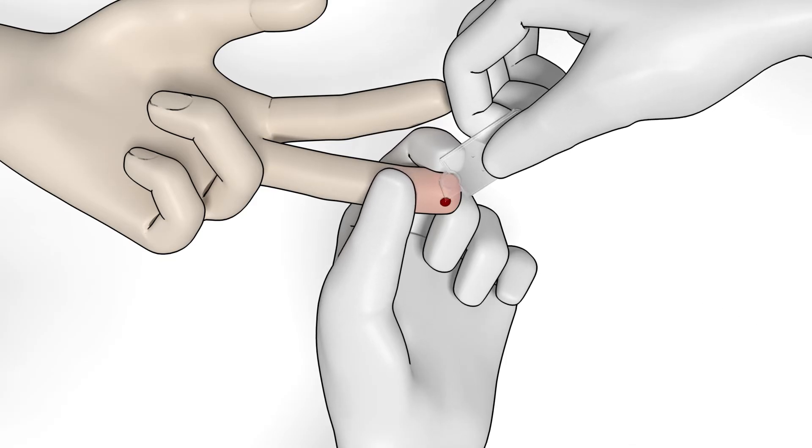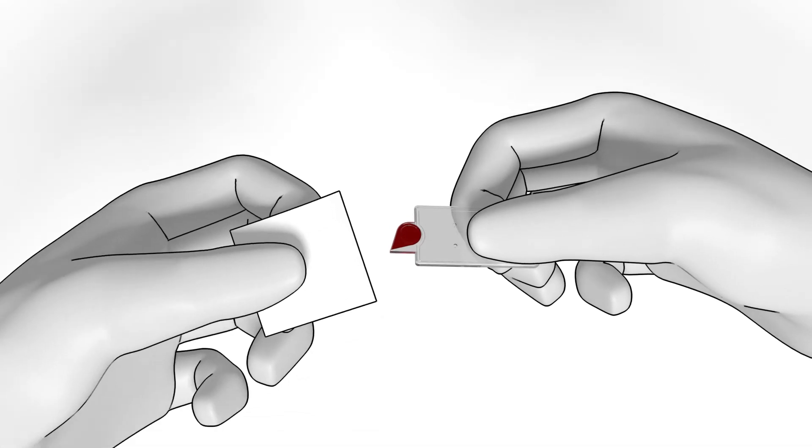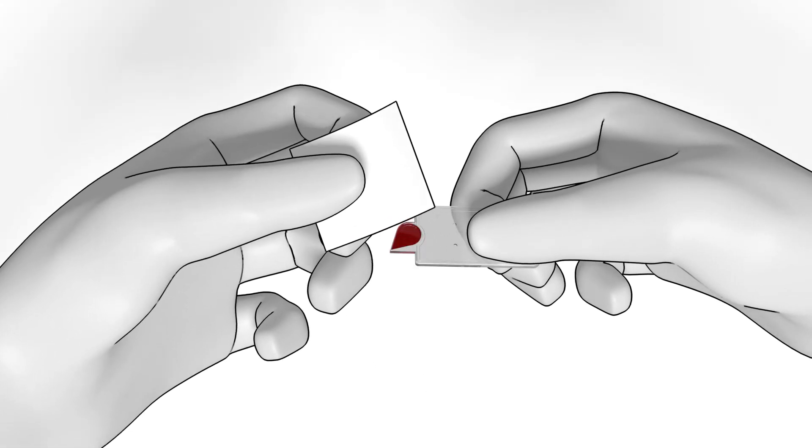Fill the micro-cuvette. Make sure the drop of blood is large enough to fill it completely. Do not refill. Wipe off excess blood from the outside of the micro-cuvette.